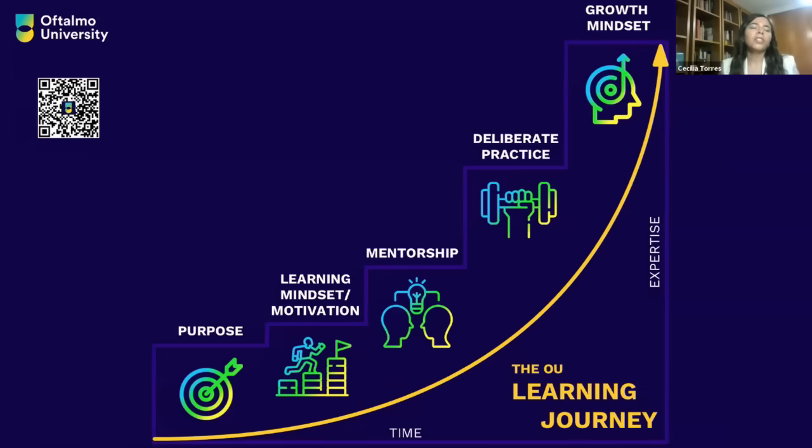Yeah, I think it all starts in the operating room. You have to open your eyes. The first 10 or 20 surgeries I assisted, I wasn't able to see the tear in the posterior capsule until the surgeon told me it's broken. It's a tear there, because we have to learn to see through different transparent planes. You have the cornea, the anterior capsule, the posterior capsule, and it all happens there, visible and transparent at the same time. So the first step is to open your eyes and learn to see.